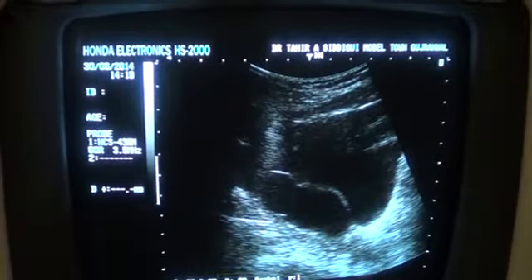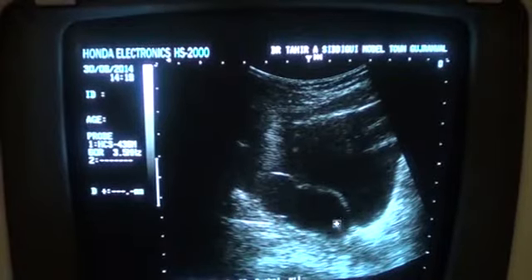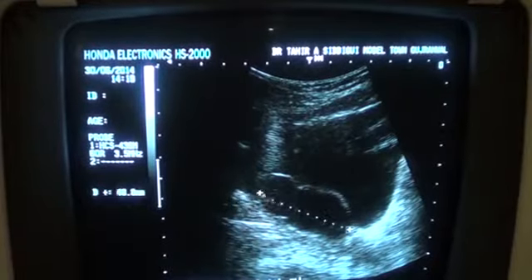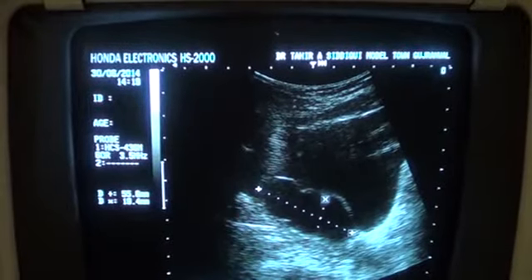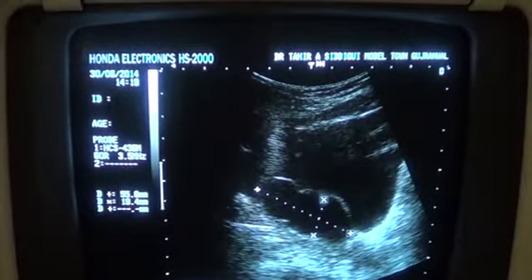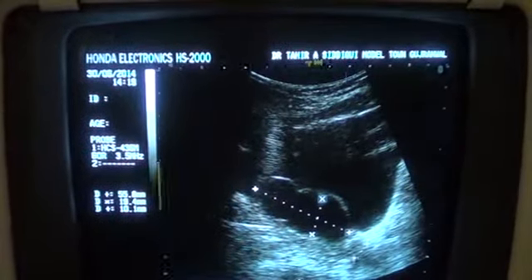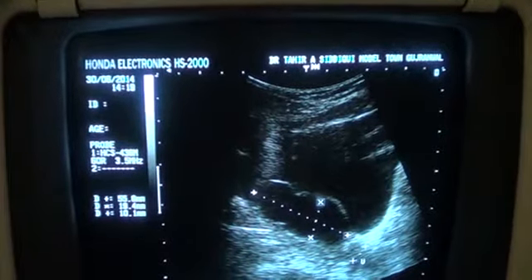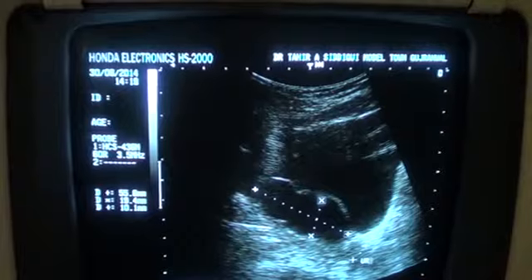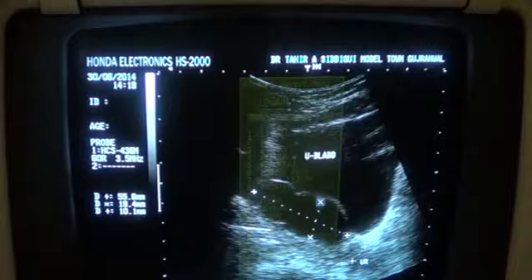Again I will show you. This is the dilated ureter full of echoes, pus or bleed. This is the ureterocele. Now actually this ureterocele measures, this is the measurement of the ureterocele, and this is the dilated distal ureter, left sided, which is entering the urinary bladder. This is the ureter. So this is the urinary bladder, and this is the cystocele.